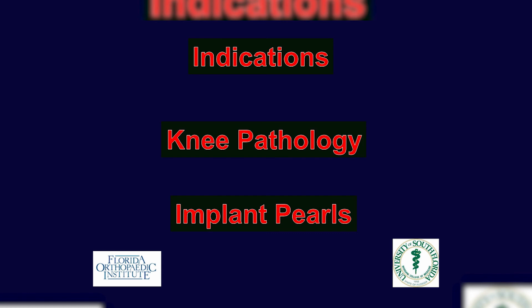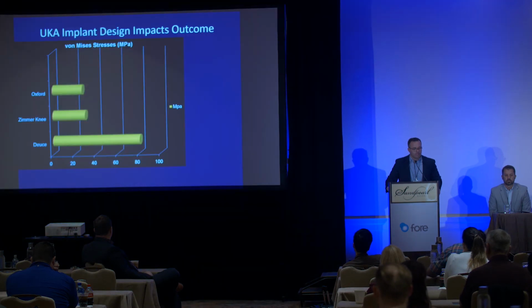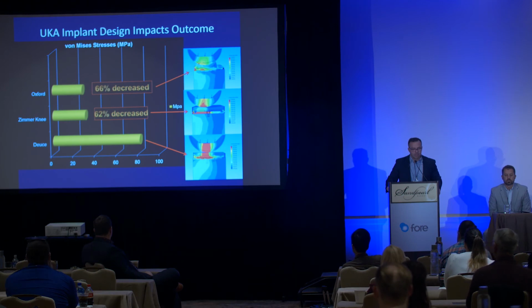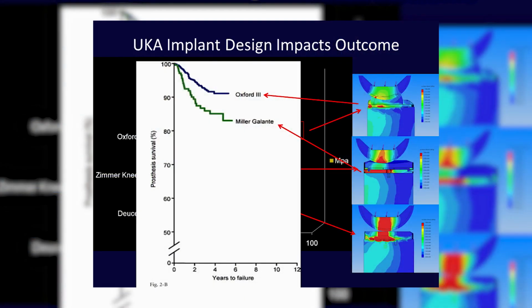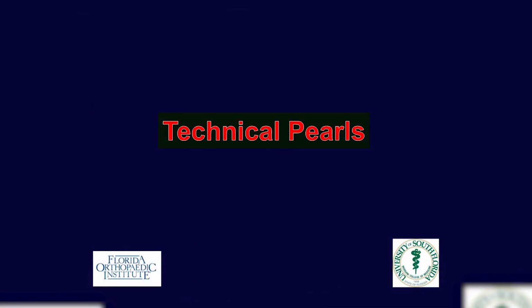So just to touch on implant pearls and some technical pearls briefly, I think the point regarding implants is a significant factor. There are probably a multitude of different geometries and implants in the market. There are really only several tried and true implants with long-term track records. Some of the work we did years ago evaluated geometries of specific base plates and found that certain base plates had higher intrinsic stress and micromotion than others, and these directly were associated with good or poor clinical outcomes, specifically in the registry data. So implant design is really rather important and shouldn't be ignored, and you shouldn't just use any implant on the market.